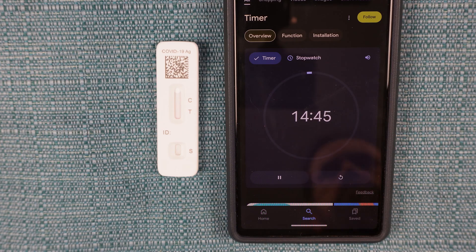Then let it sit for 15 minutes. Don't lose track of time because the test is invalid after 30 minutes, according to the instructions.